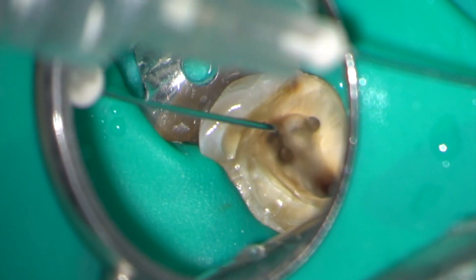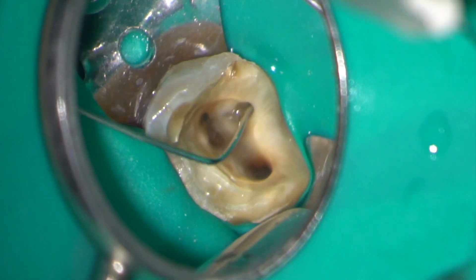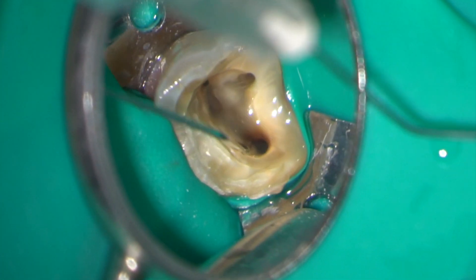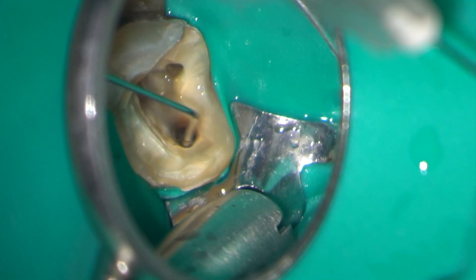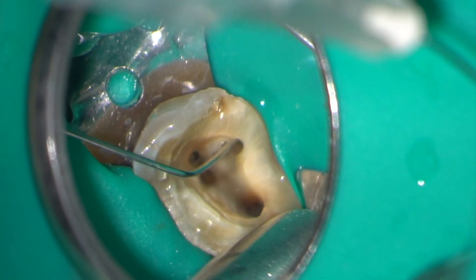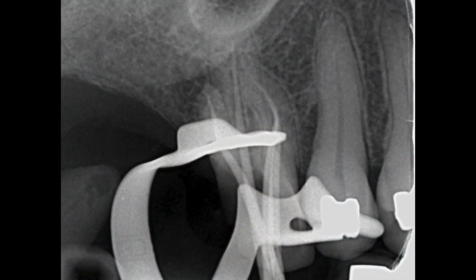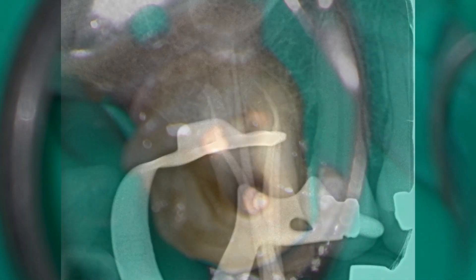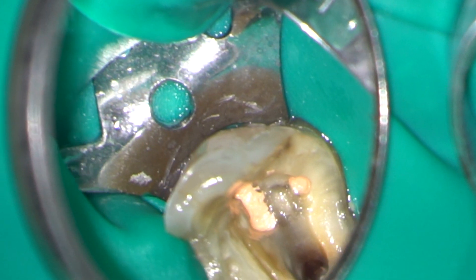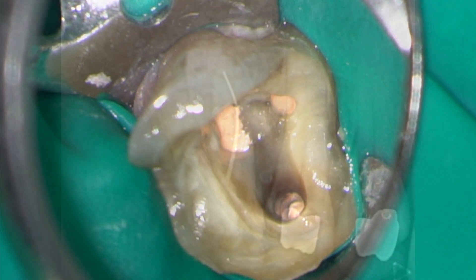There is confluence between the MB1 and MB2 canals. A cone-fit radiograph was exposed before obturating with a vertically compacted gutta percha technique. A core was fabricated using dual-cure composite and a fibreglass post in the palatal canal.